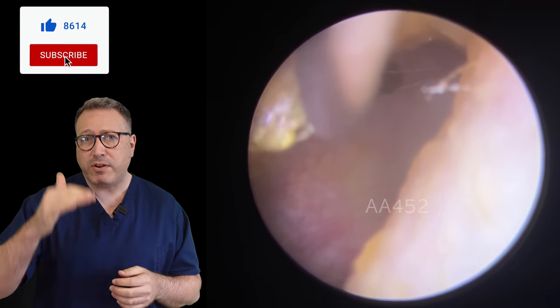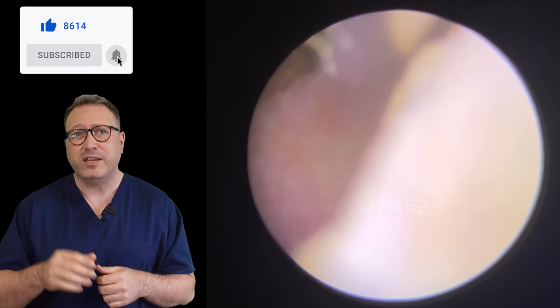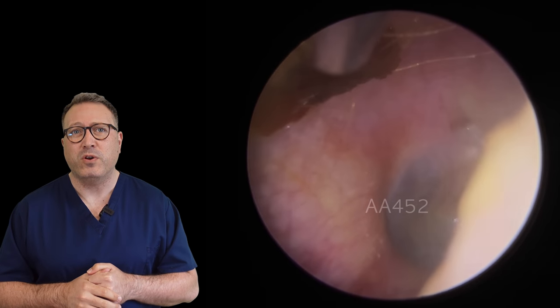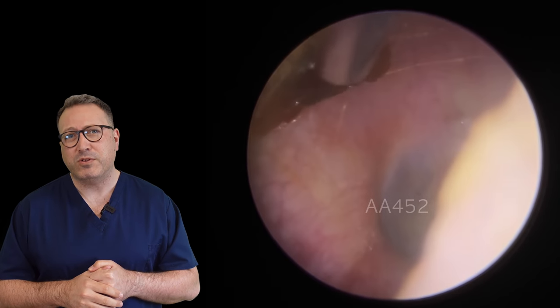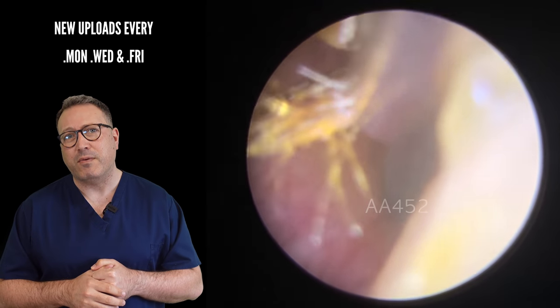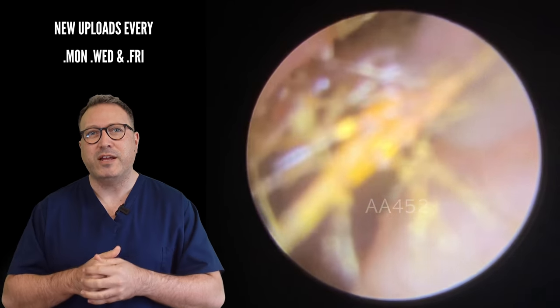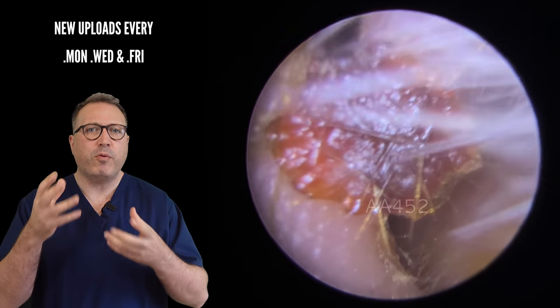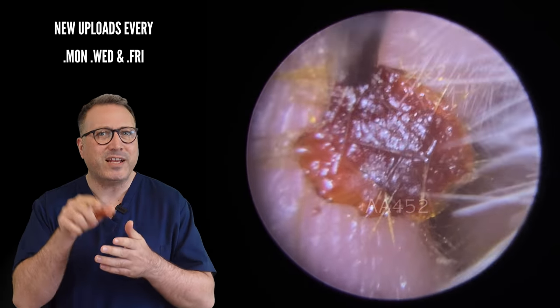There's a little piece of wax right at the very top of the canal, so we've got the fine end on here — a slightly finer tube — so we can do more delicate pinpoint work. We're just going to peel this from the top of the canal. There we go, starting to come away. You can see a couple of little bits of hair on the outside edge as well.